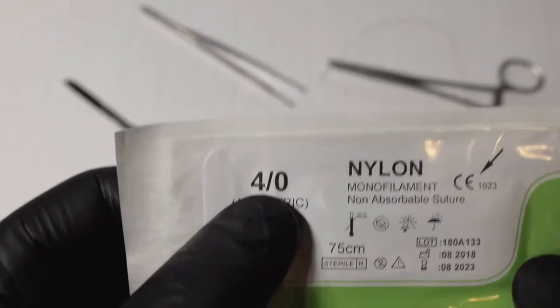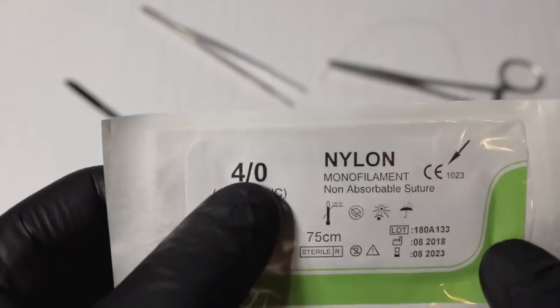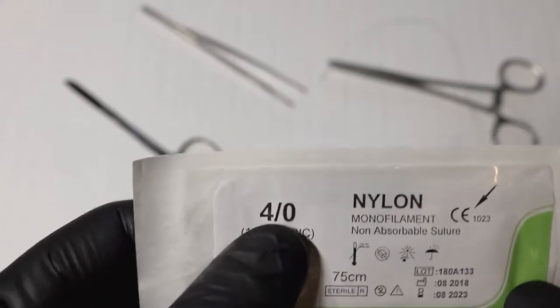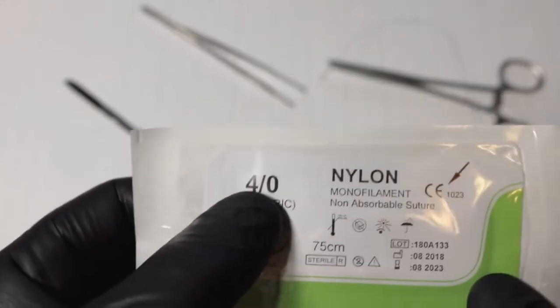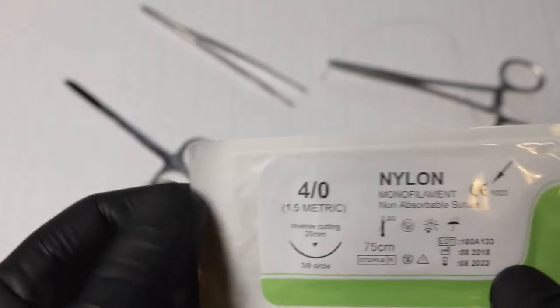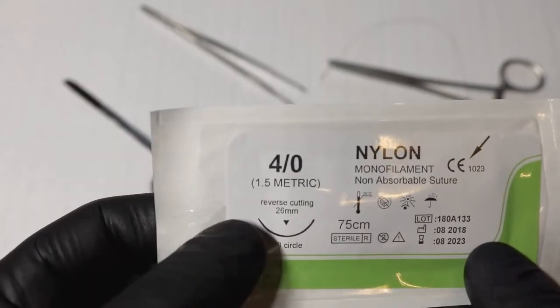The main thing to know is the sizing: on the face you're going to use a 6-0 or 7-0, since you want a finer suture to minimize scarring. A 4-0 is your go-to for most repairs, and 3-0, 4-0, and 5-0 are the sizes I use most often unless I'm working on the face.